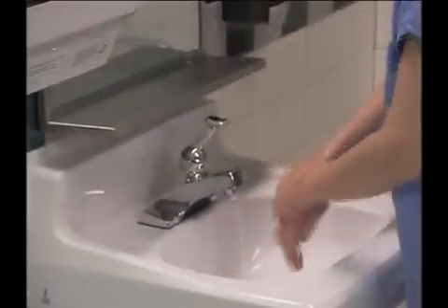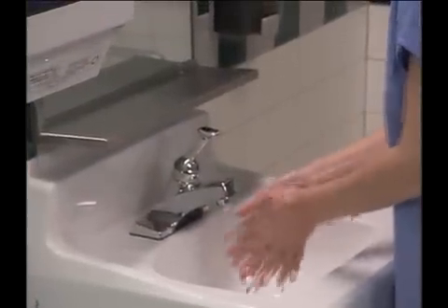Position the wheelchair according to the person's preference. Then complete your finishing up steps as described in the final section of this video.